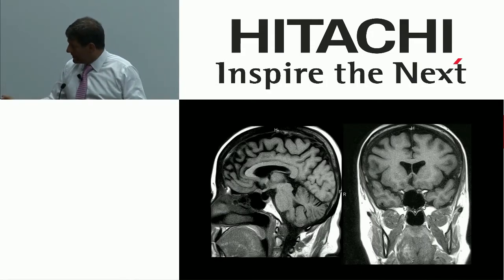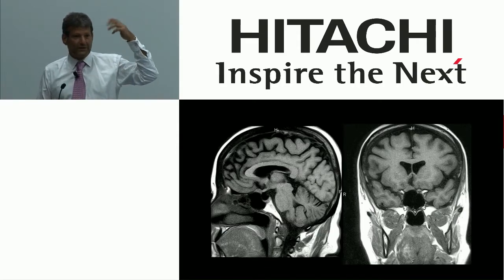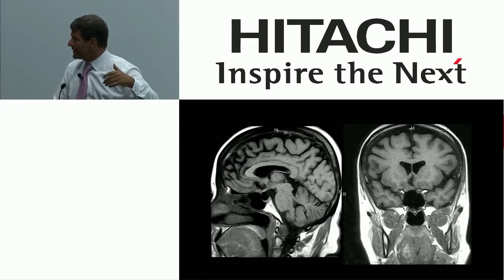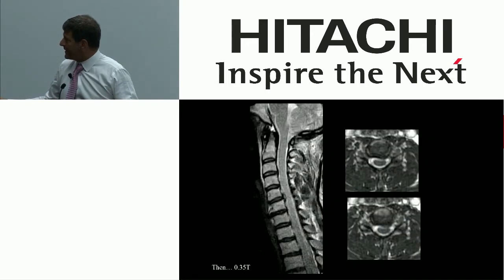Okay, here. This is a very small lesion. See this little bump right there? It's a meningioma. I think I was seeing there was a movie star recently that was revealed that she had a meningioma in the frontal and just had surgery. Actually, I think one of the news anchors. That's the kind of lesion we're looking at.